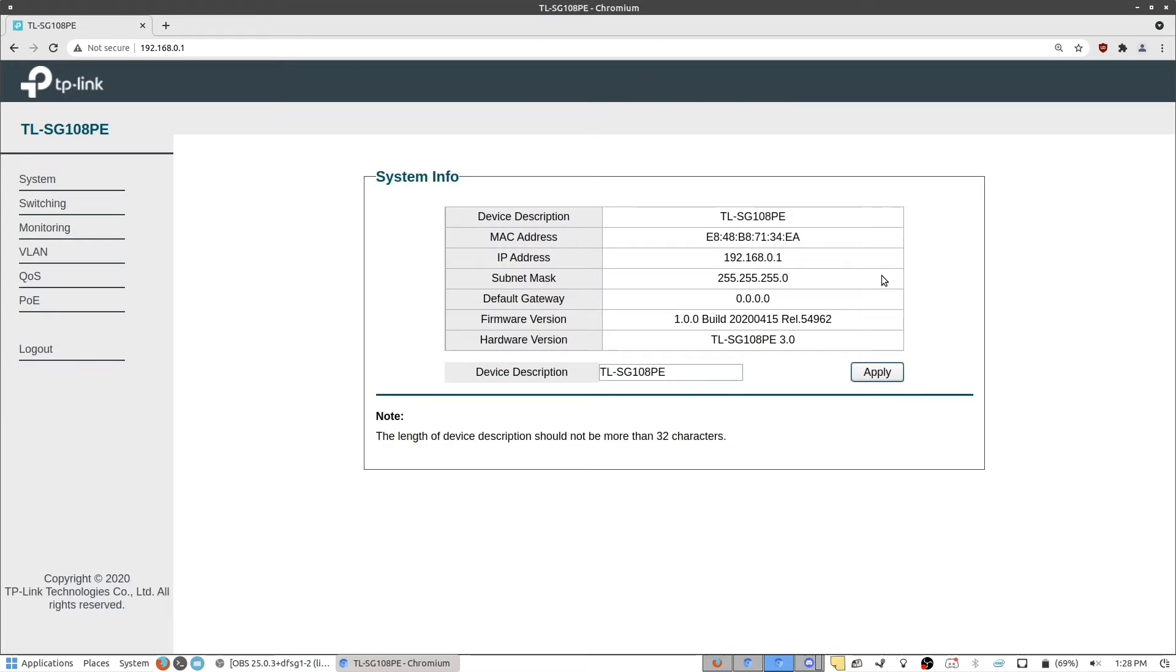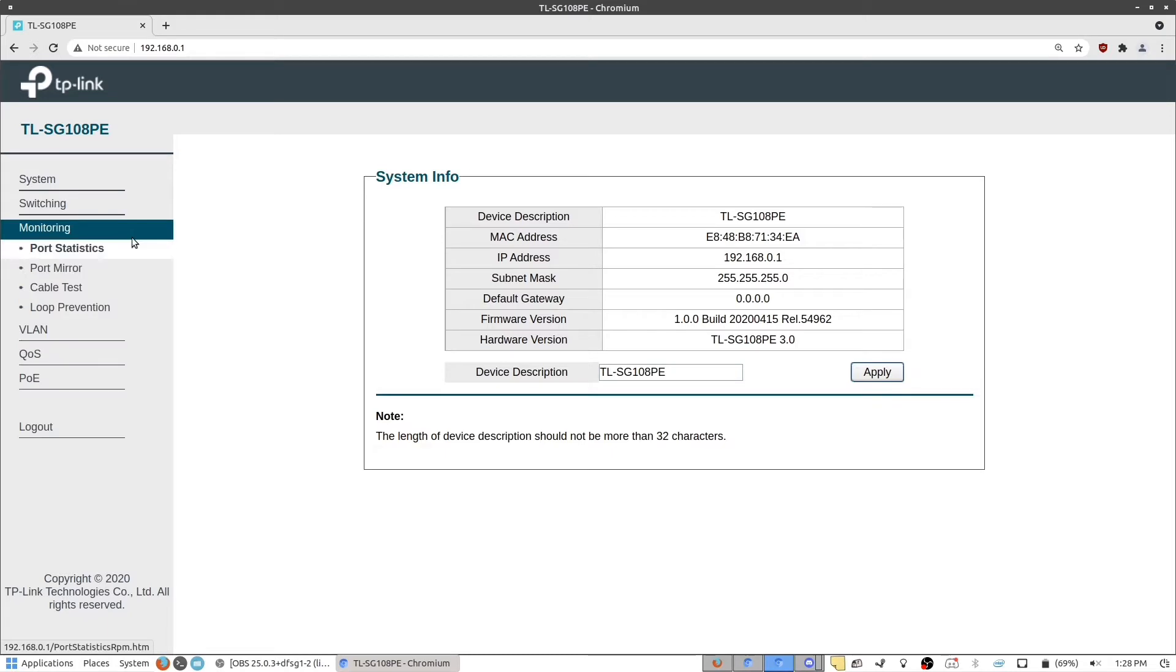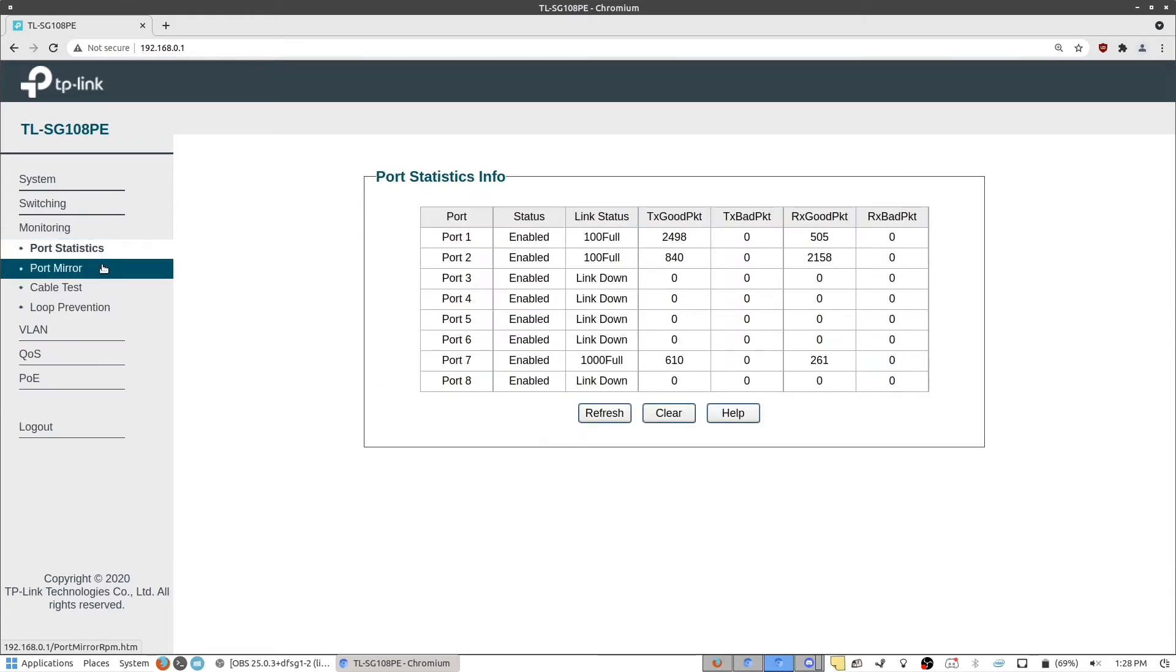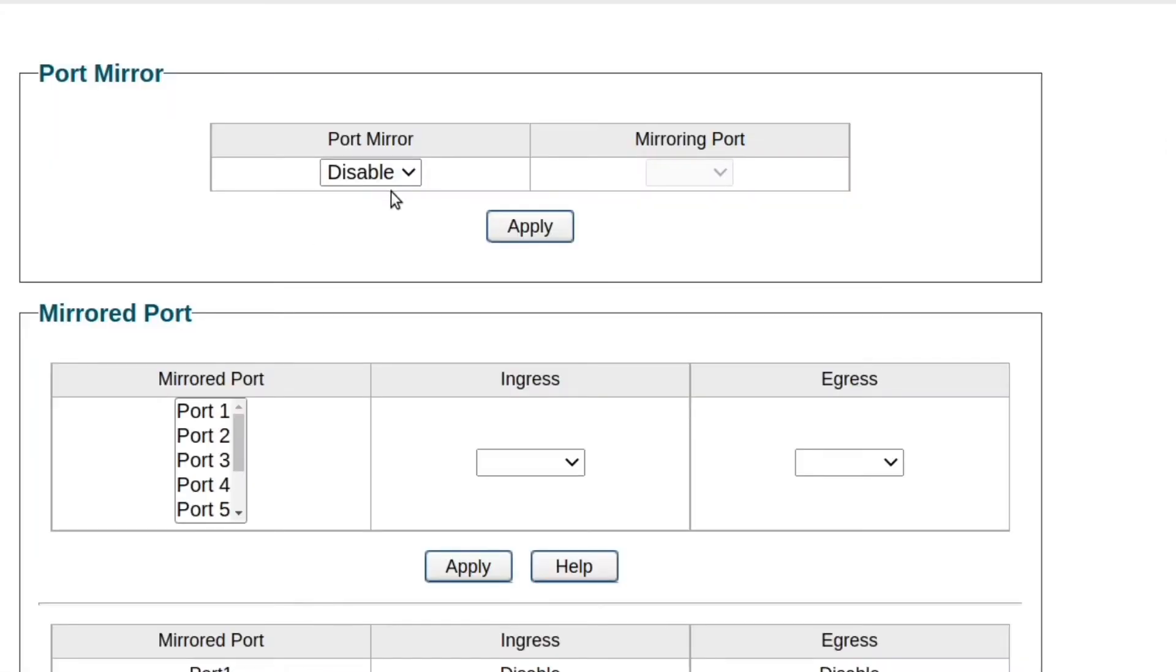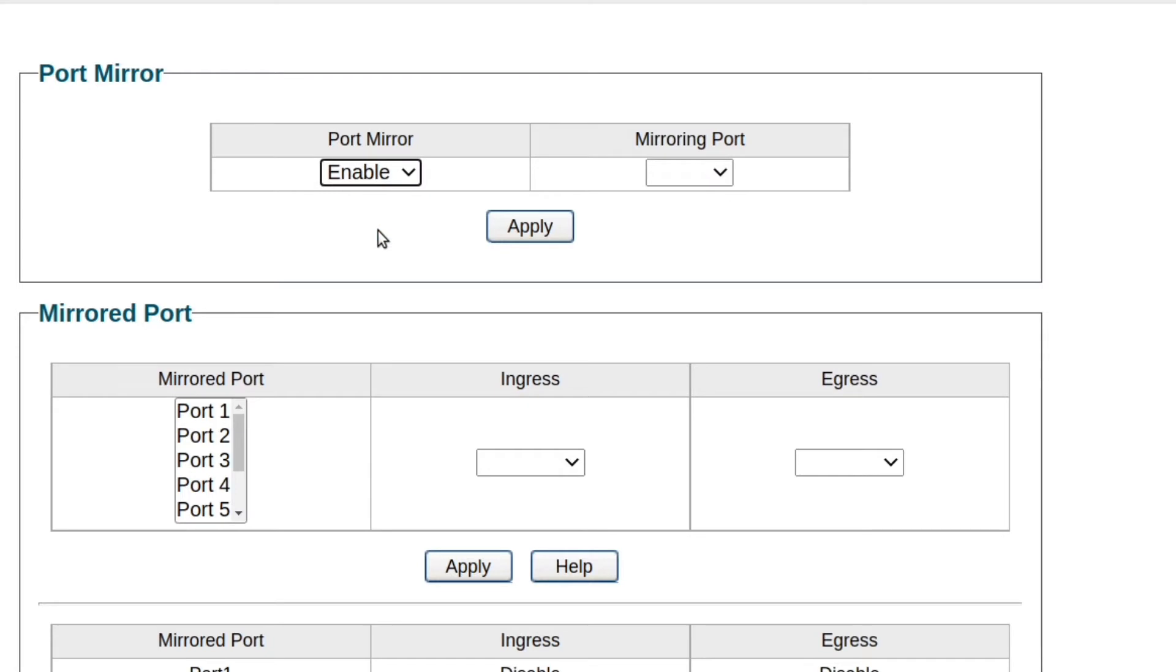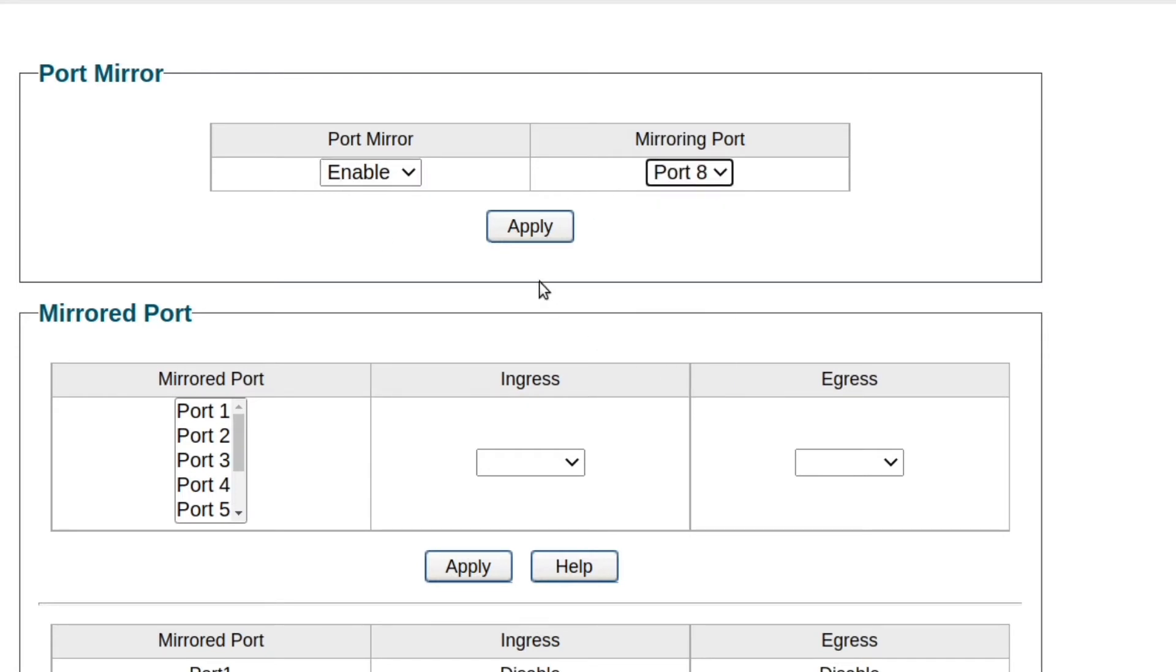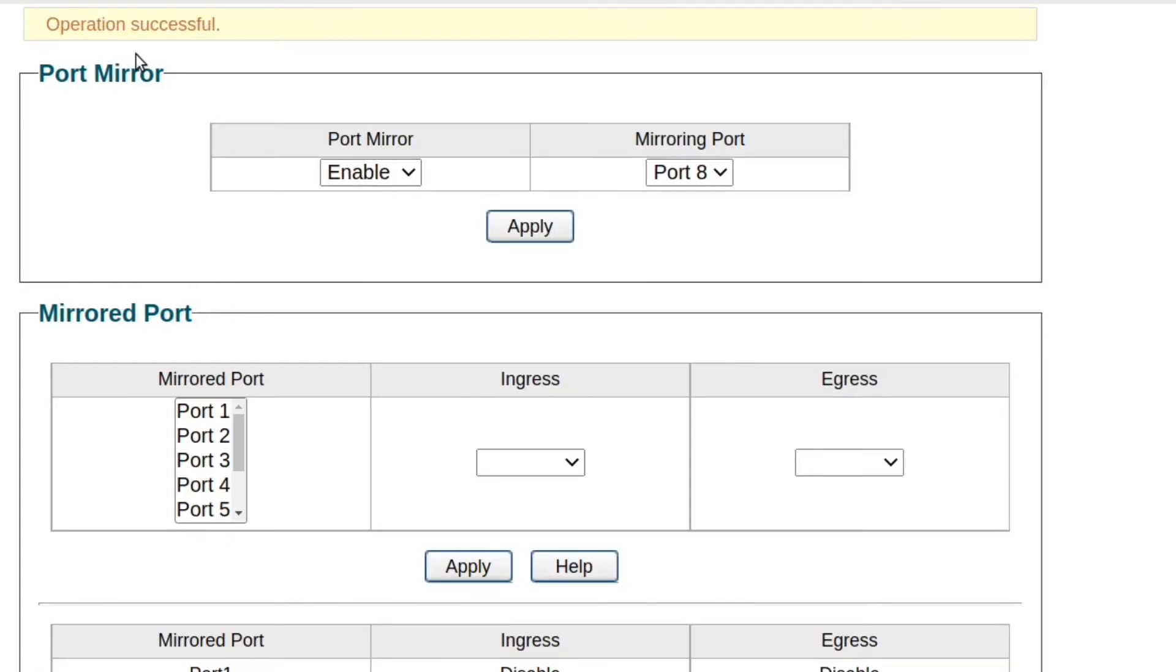And from here, what we want to do is go to monitoring, and then port mirror. At the top here, you can see you have the port mirror option, and right now it's disabled. So we want to go and select that to enable, and then select port 8 as our mirroring port. Click apply. You'll see at the top, our operation is successful. That just means that port mirroring is now enabled, but it's not actually set up yet.